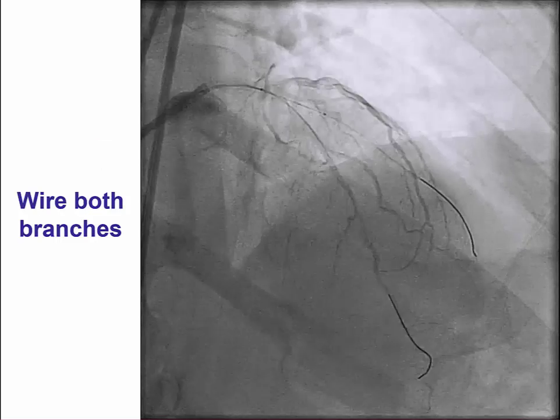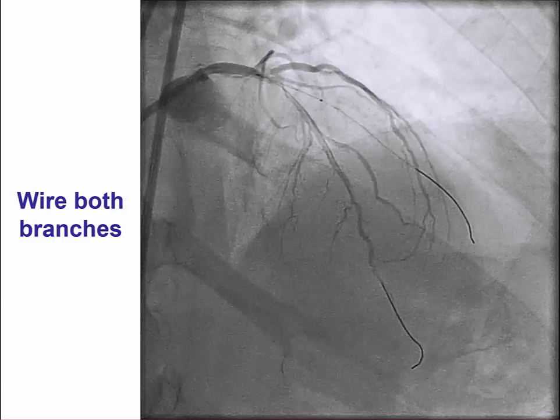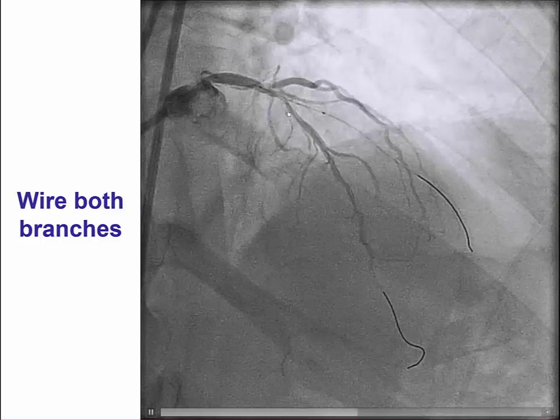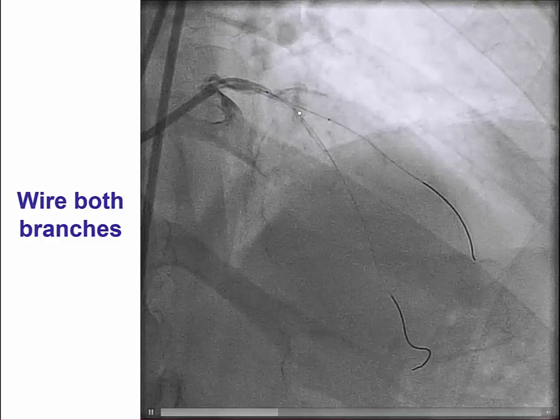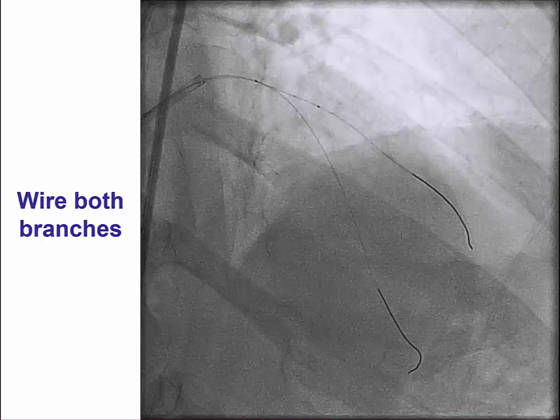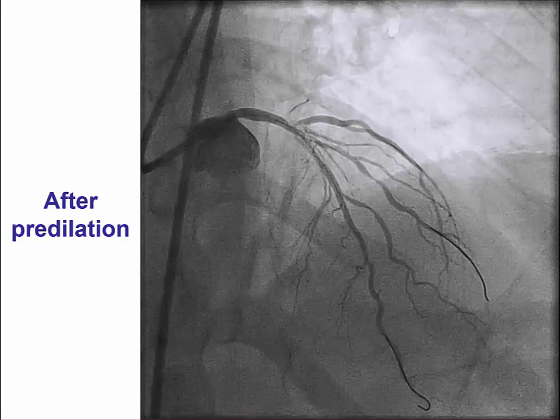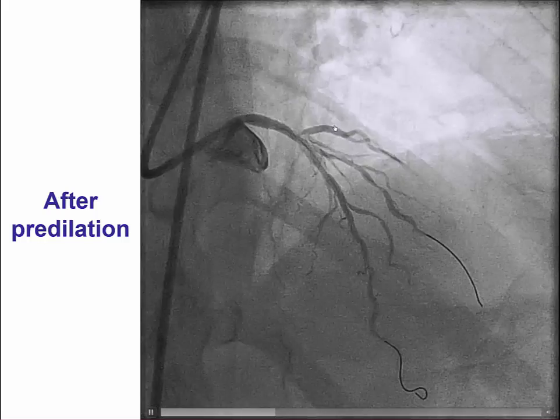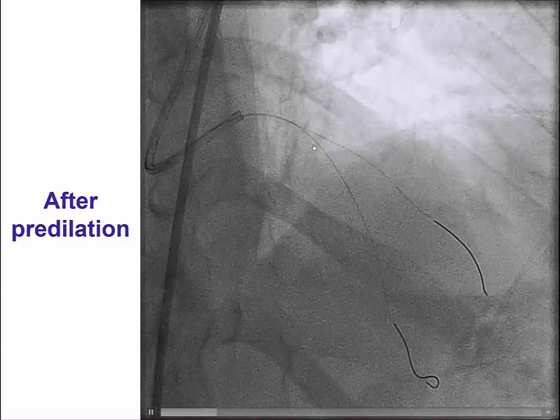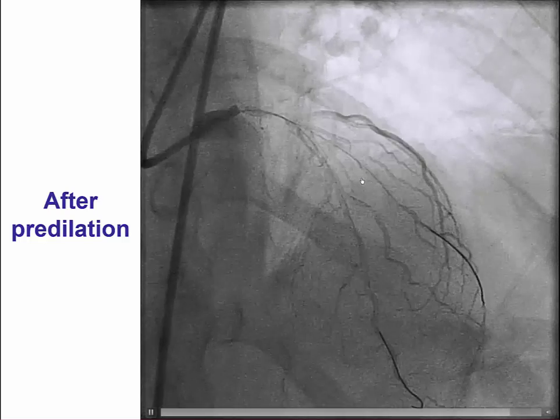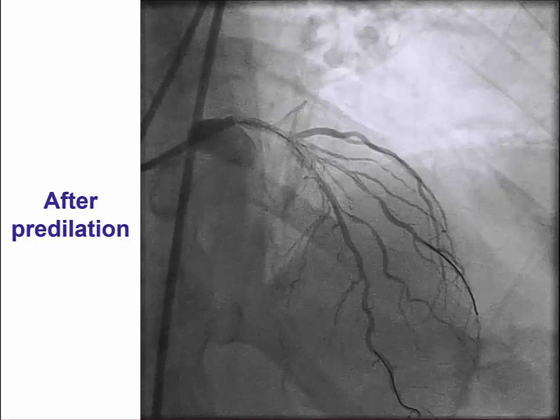So how is this DK CRUSH performed? The first step, as with any bifurcation, is to advance guide wires in both branches. We have a guide wire in the diagonal as well as the LAD. Then both branches are predilated to ensure good stent expansion. Balloon angioplasty was done on the diagonal and in the main vessel with a 2.0 mm balloon, demonstrating some dissection in the main vessel as well as the side branch ostium, which may increase the risk of side branch occlusion when a stent is placed in the main vessel.